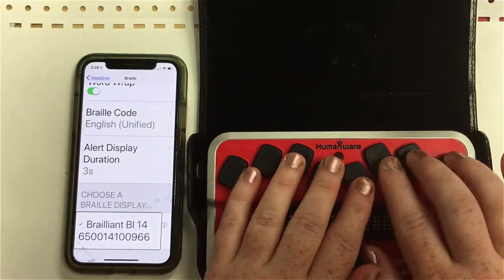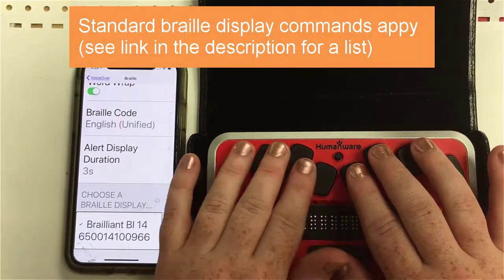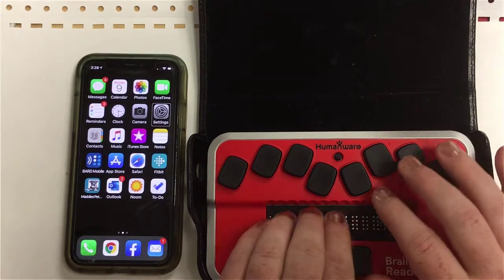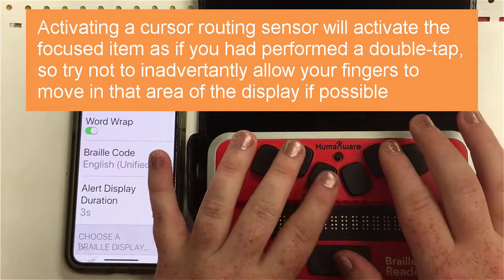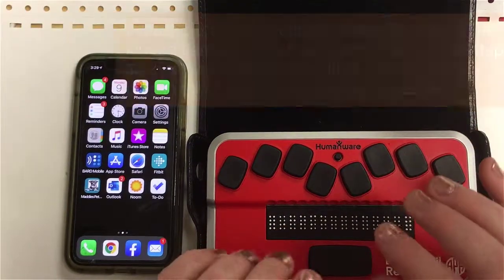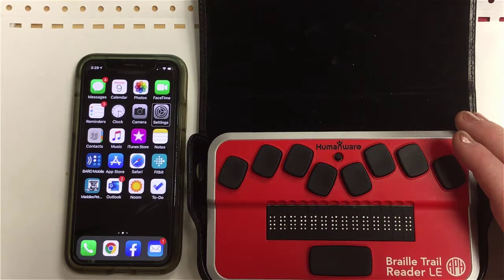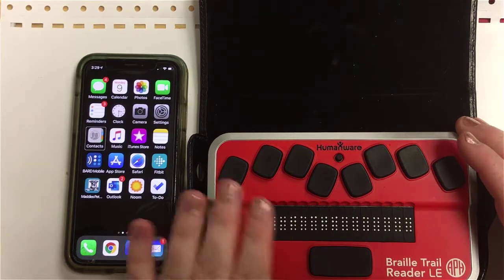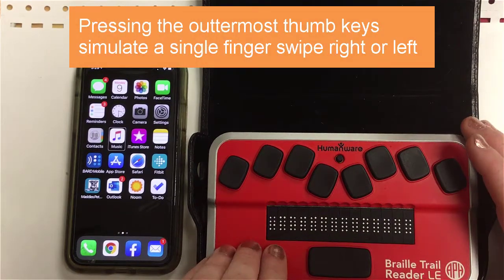It works just like any other Braille display. I'm going to do Space plus the letter H to go home. Now to navigate, I can use my outer thumb keys. Sometimes those cursor routing sensors can be more sensitive than you want them to be, so it's important to monitor that and realize you may have pressed those sensors inadvertently. But I'm navigating the apps now without touching the phone, just using the thumb keys.